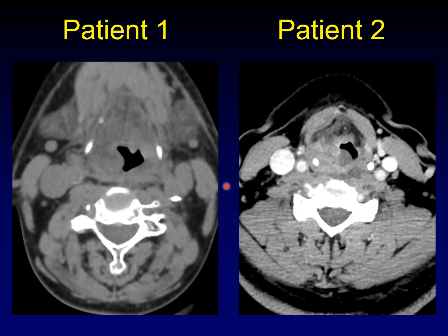What are the differences between these two cases? On patient number one, in addition to the thickening of the supraglottis, we're also seeing thickening of the platysma muscle and stranding of all the fat really on both sides of the neck. We're not seeing that in patient number two. In patient number two, we're seeing this ill-defined enhancement throughout the area that we are interested in.